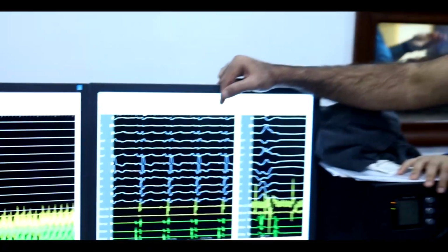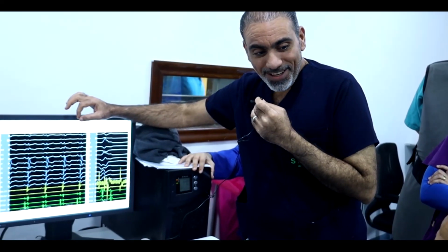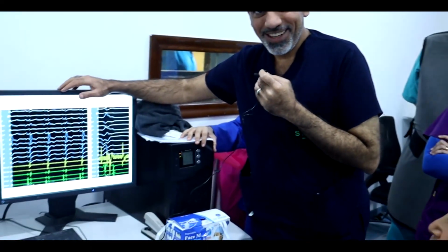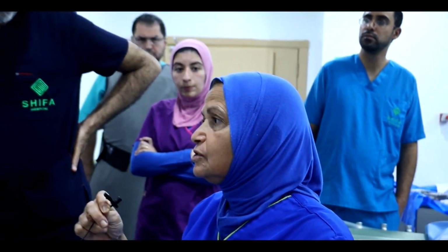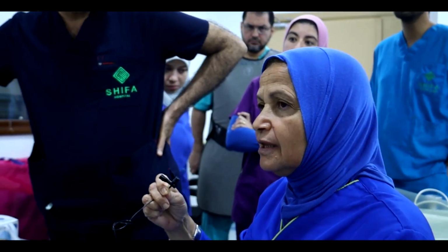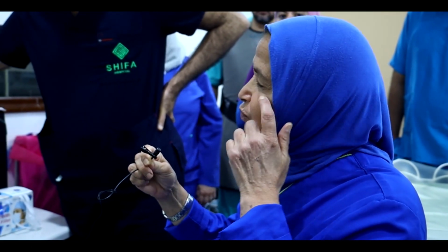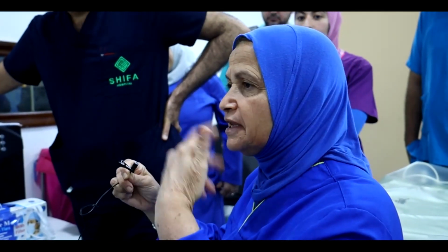This is the resting ECG, typical right bundle. From the beginning we identified the His and were very careful not to ablate beside the left bundle to prevent complete heart block. So you took your precautions not to ablate the left bundle because he already has a right bundle. I think in the first study we got a trauma to the left anterior fascicle and it came back.